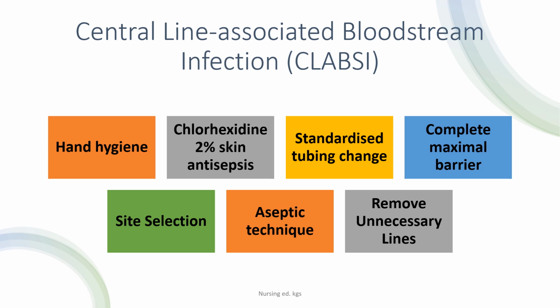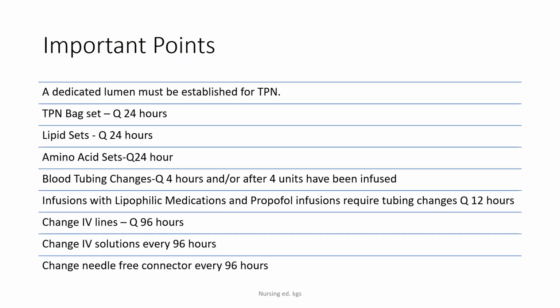Always remember to scrub the access port or hub immediately prior to use with an appropriate antiseptic, and removing any unnecessary lines.